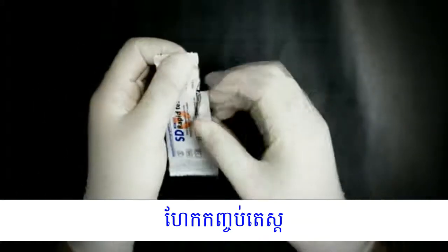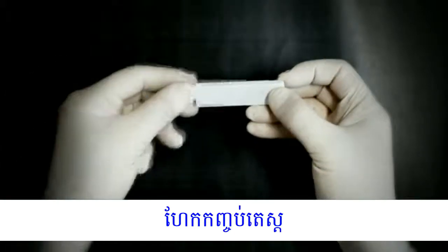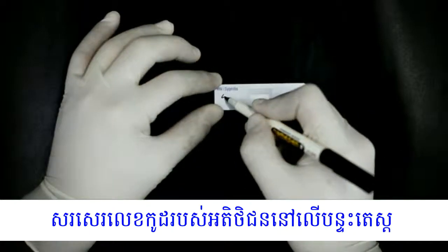Open the test pouch and set the test device. Write the patient's identification on the device.